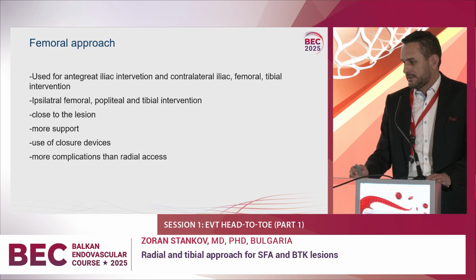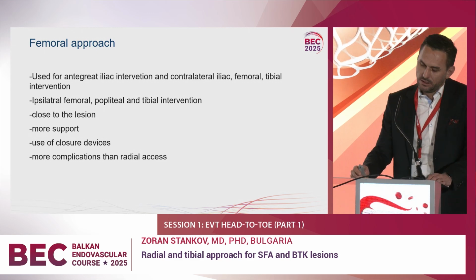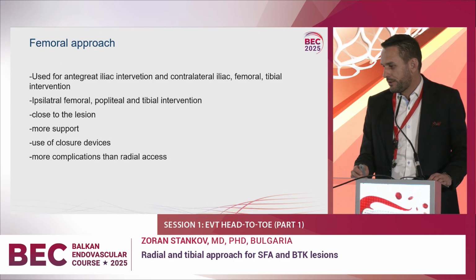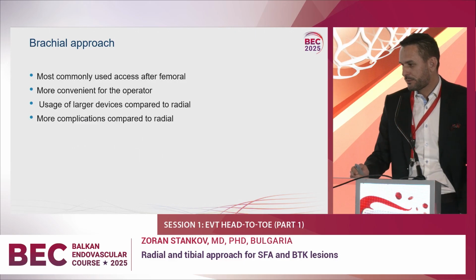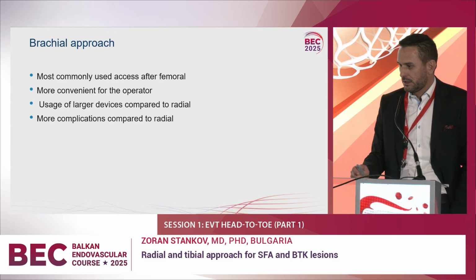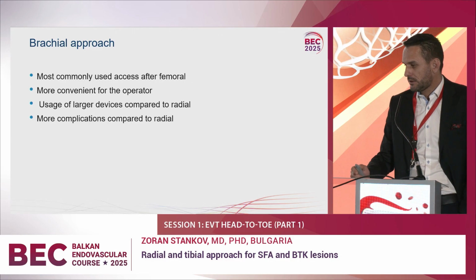But what is the situation compared to radial and femoral approach? The femoral approach still has more complications compared with the radial access. The brachial approach has returned in the last years for total endovascular procedures.